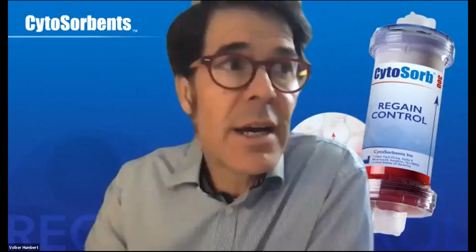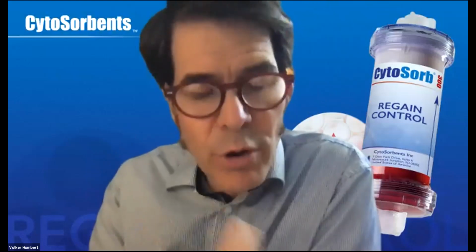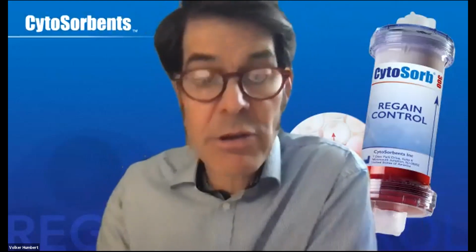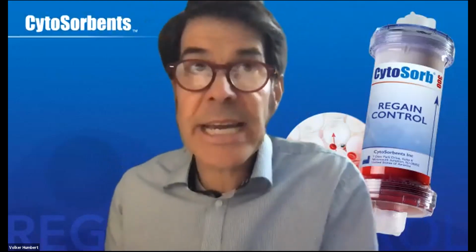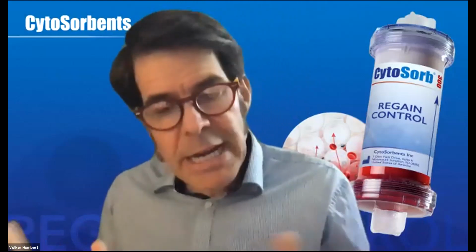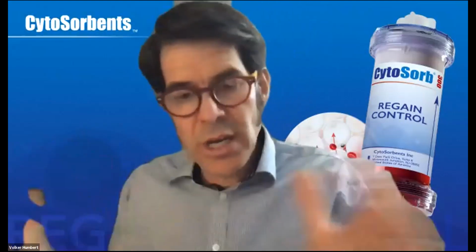Those numbers always have to be seen in the complete picture. As I said, Cytosorb has a concentration dependency. The higher the levels, the more efficient it is. At very, very high levels, we have really seen very rapid reductions of cytokines. If you have lower levels, then the reductions are no longer that pronounced. So 80% is a very high number, I have to say, for cytokines. It might be given in an in vitro setup. I think in vivo, you probably don't have 80% in 2 hours. I think this is a bit too rapid.